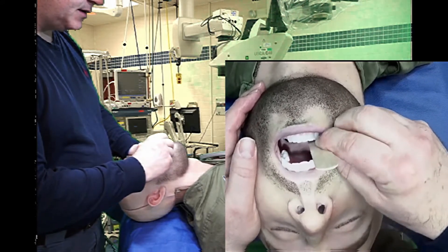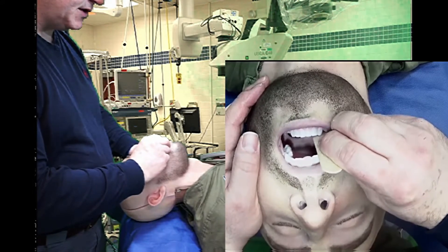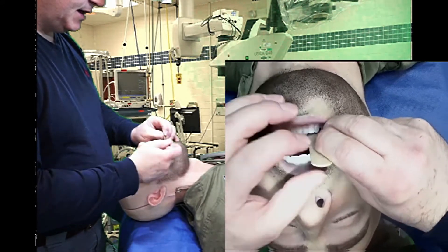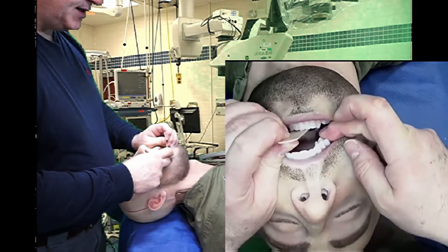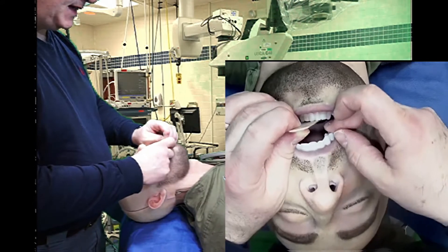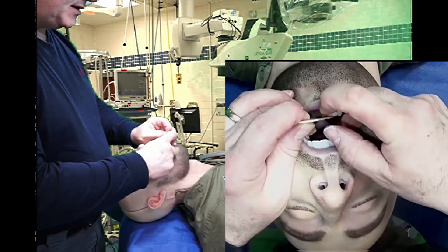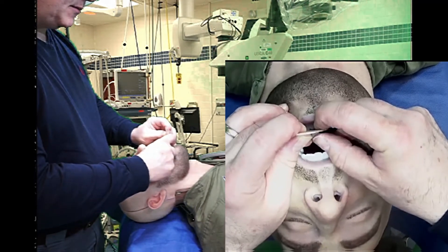I'm going to place the tongue depressor as deep as I can into the mouth of the mannequin, basically to the base of the tongue. I'm going to use my middle finger against the mannequin's upper dentition, behind the canine, more towards the molars if I can. I'm going to grasp the tongue depressor with my thumb and forefinger, my first finger.